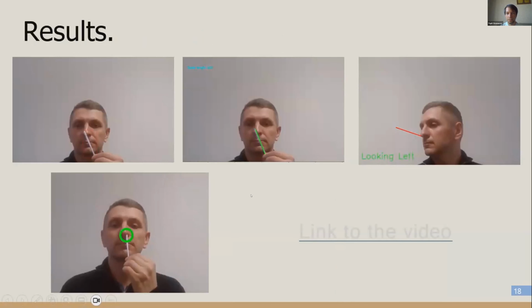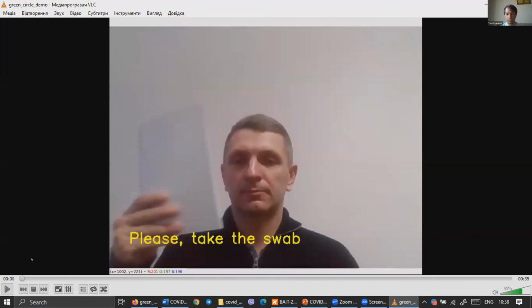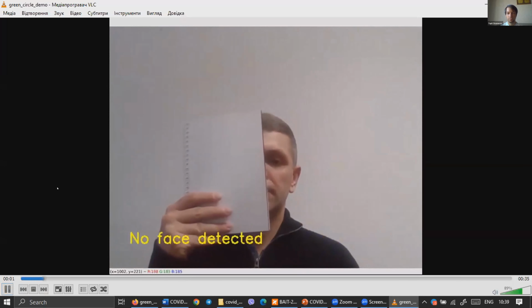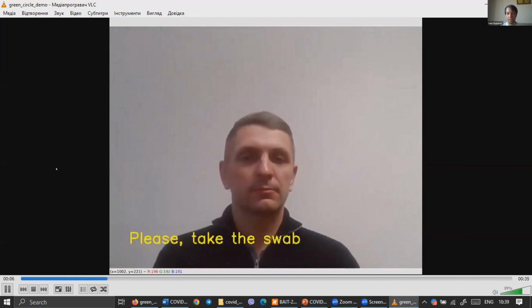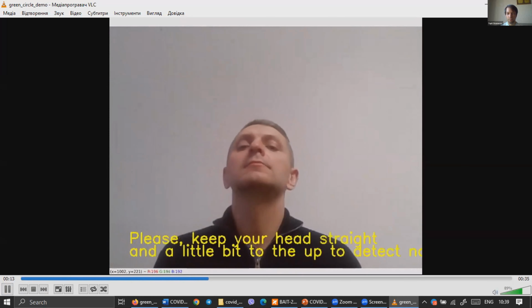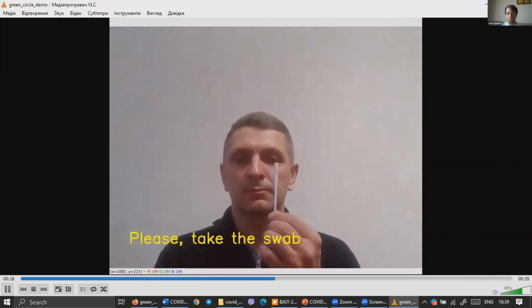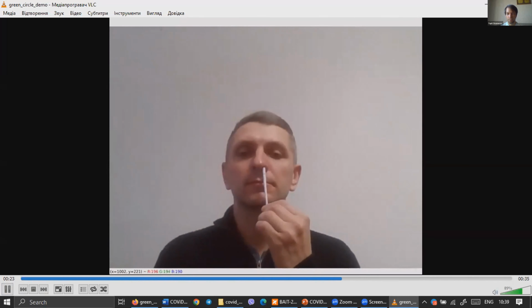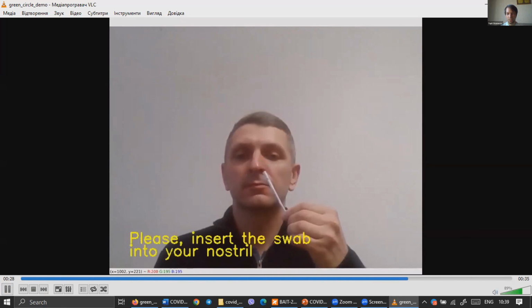And the results. Let me show you a short 30-second video. You can see a face detected, face position, swab detection, and detection of correct position of the swab.